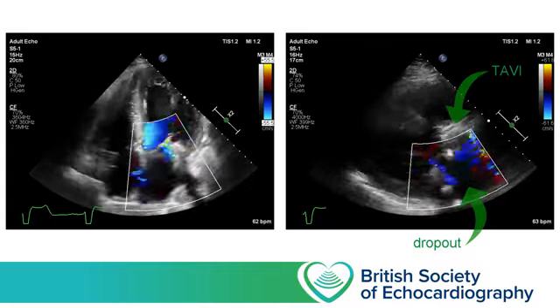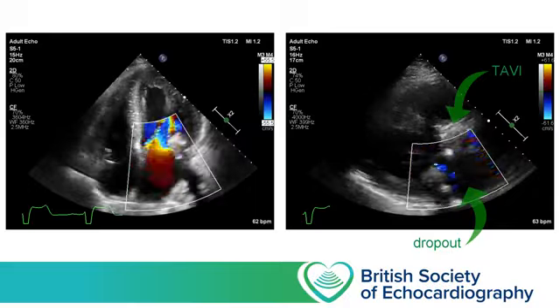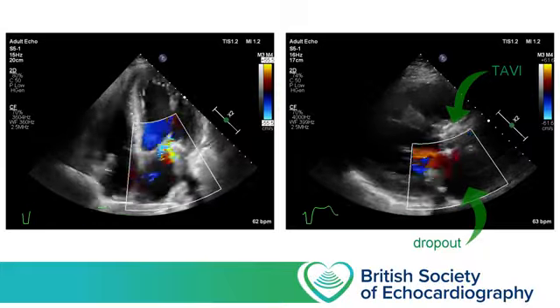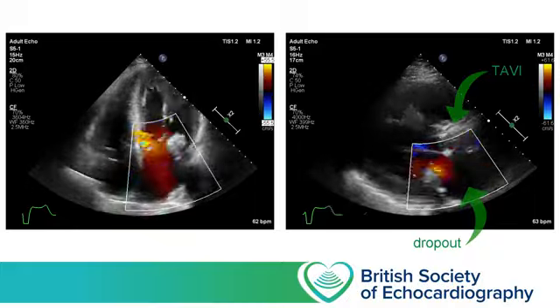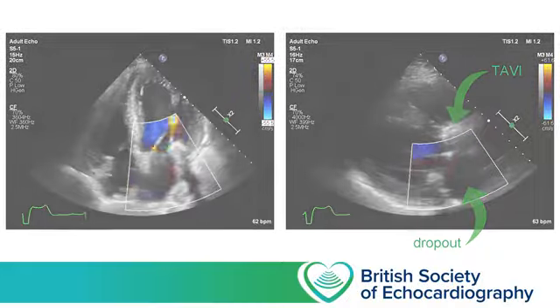We now have an unobstructed view into the left atrium, and we no longer have those shadows cast across our colour box. So our first limitation is that all of those factors that limit your ability to gather information to build up a 2D image also impact on your ability to gather the information required to build up a colour map.